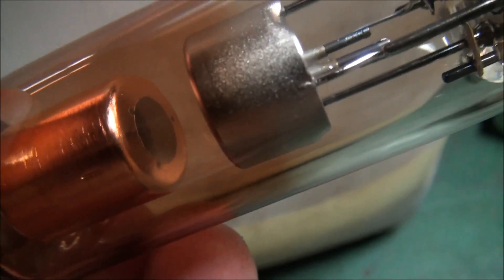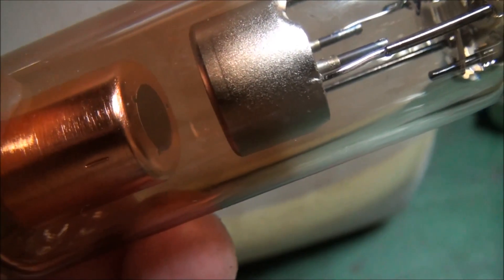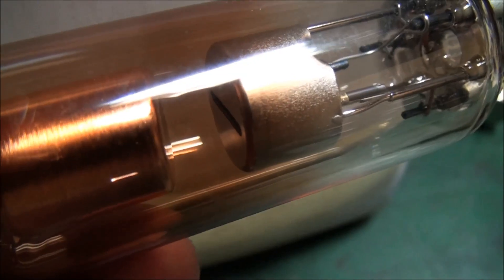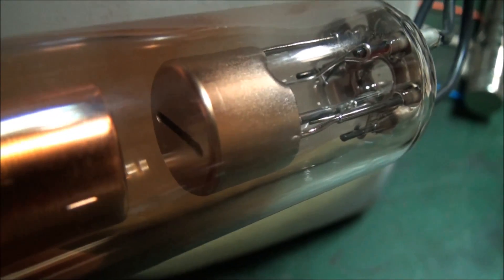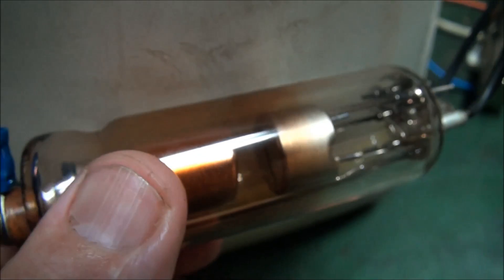The older tube has a much broader target area — it's basically a flat tungsten target which liberates x-rays when bombarded by high intensity electrons that are liberated from the cathode up here, which contains the filament.